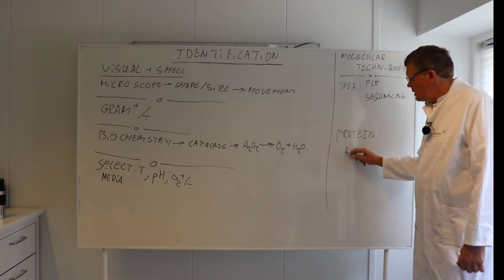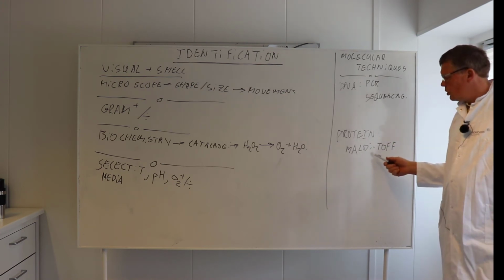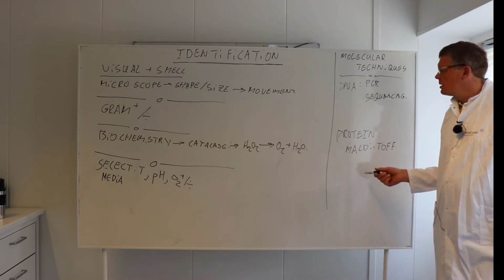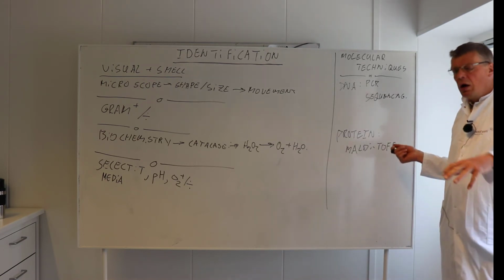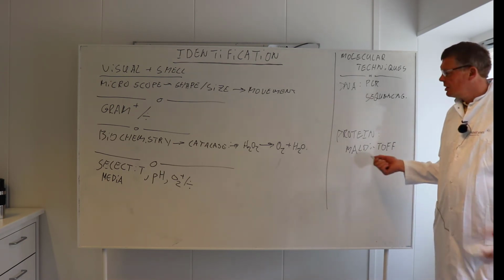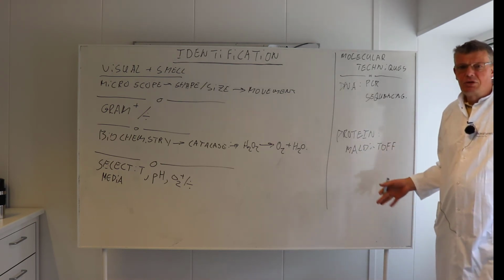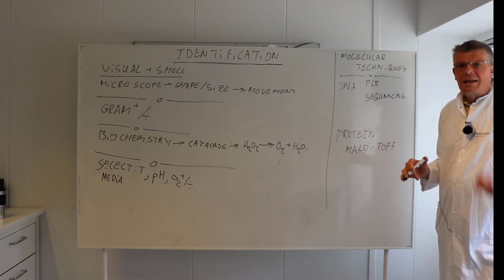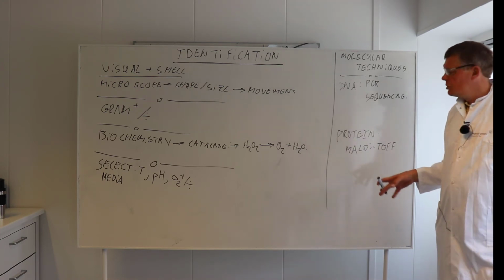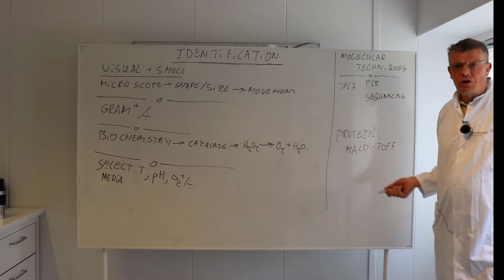Protein, it is almost only this method called MALDI-TOF. It's a kind of mass spec. And basically what you do is you put the bacteria into this instrument. You might have crushed it, and you take a colony, whatever. And in a mass spec, to put it shortly, you simply add a charge, the same charge, to all molecules in the soup of your crushed bacteria.